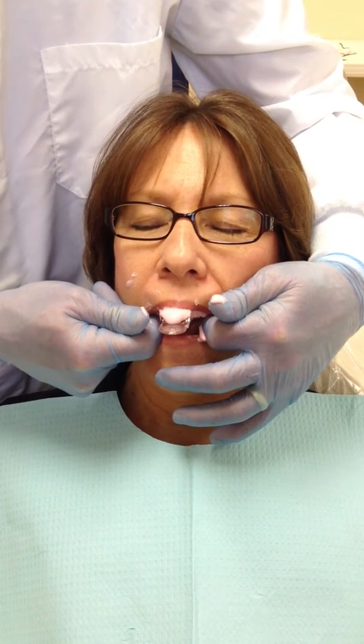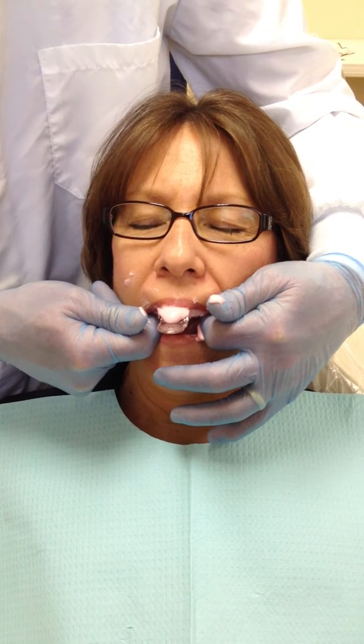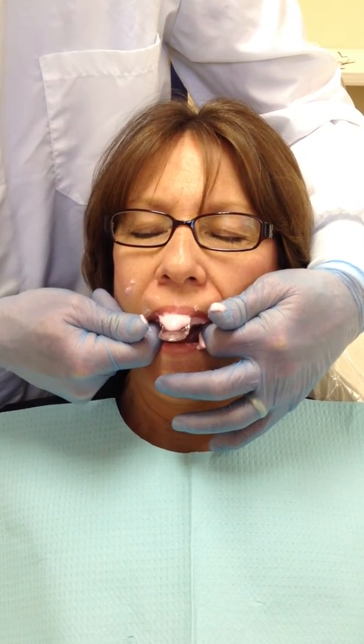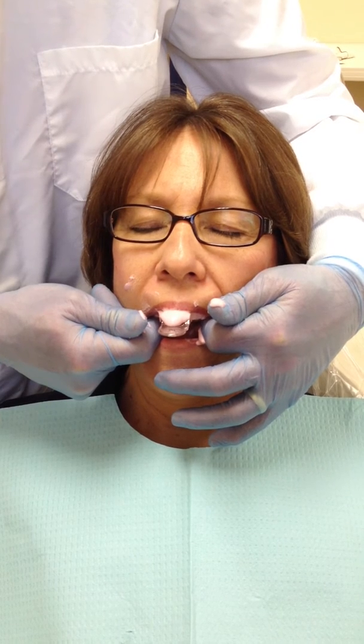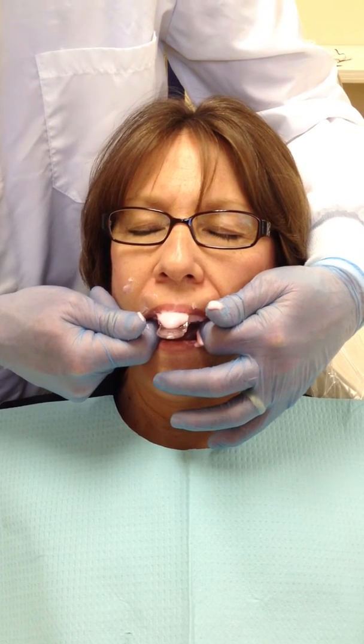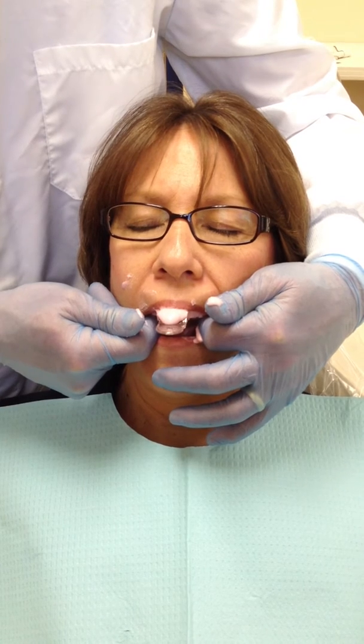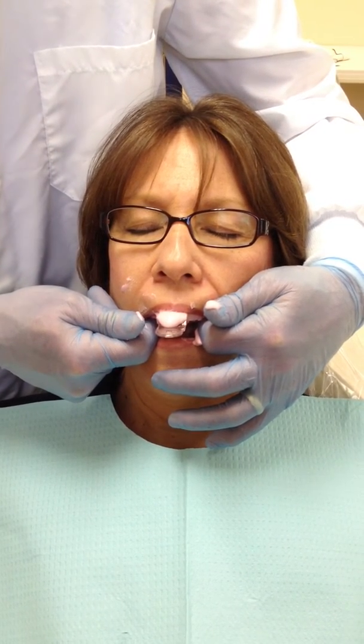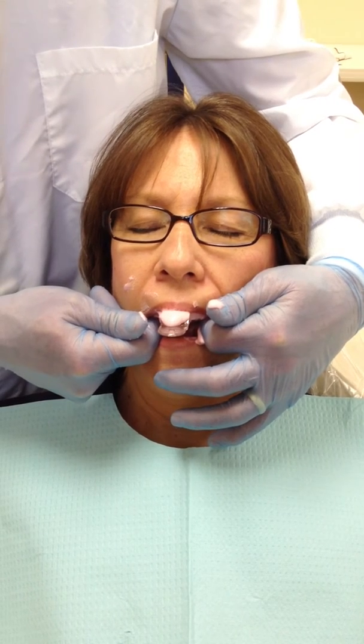Kathy is a very great patient — sometimes this is a little tougher on patients who are gaggers or anxious. We are stabilizing the tray along the molars with our two index fingers, making sure that it is in position. Right now Kathy is saying, why didn't you mix slower?